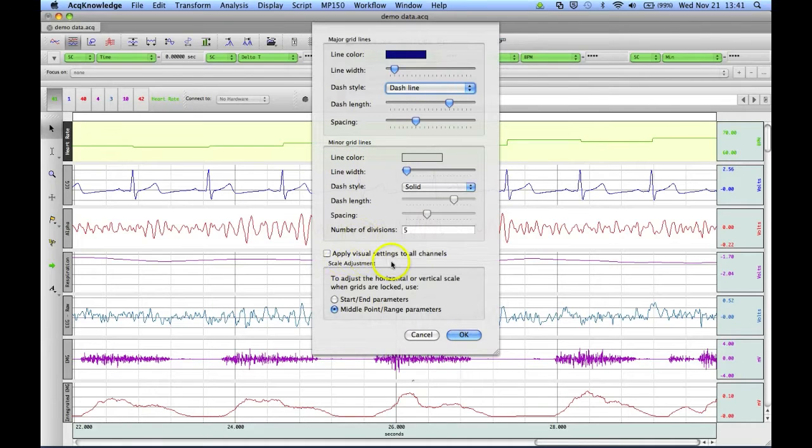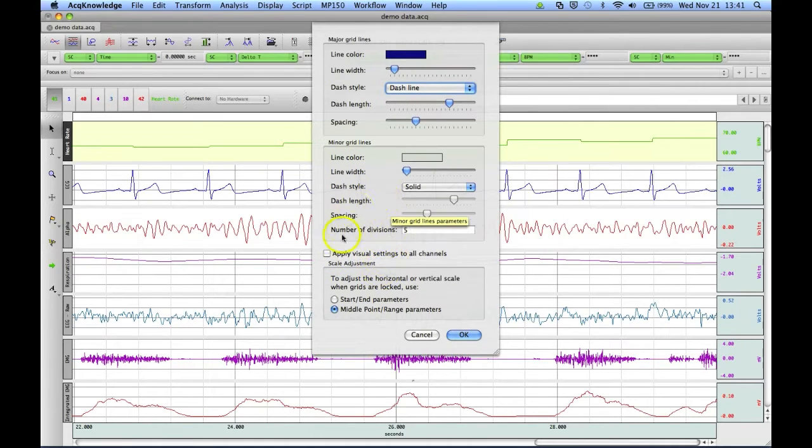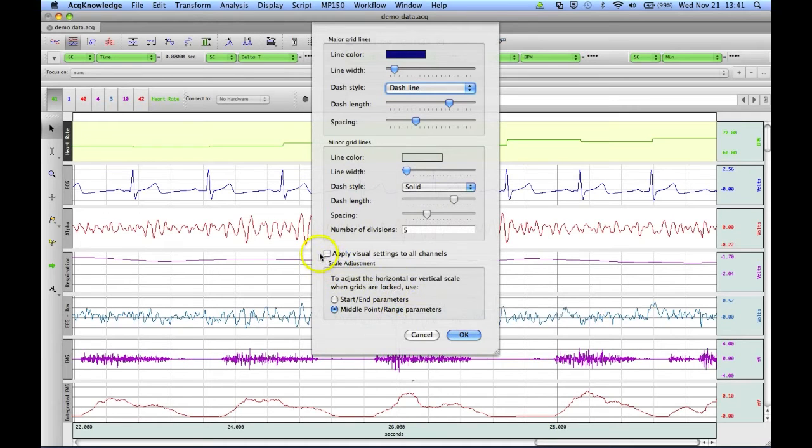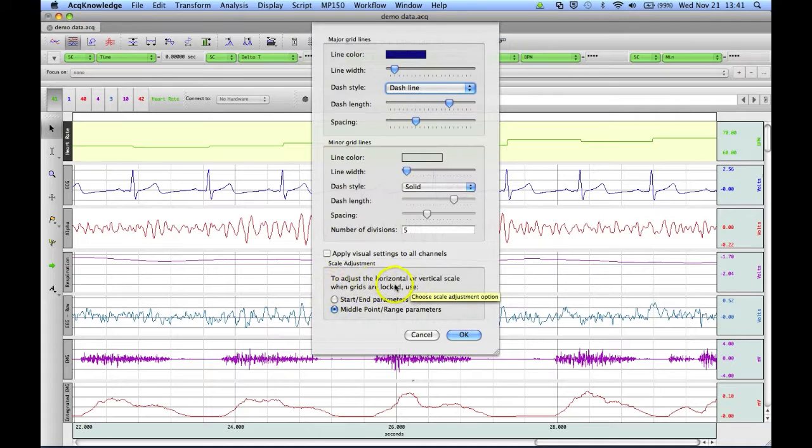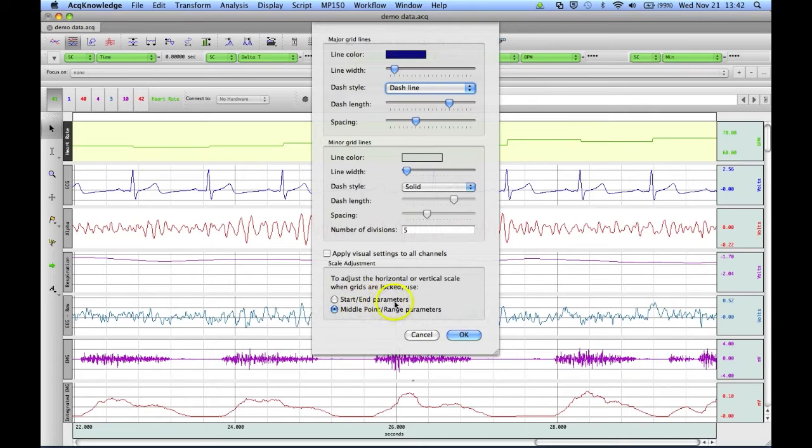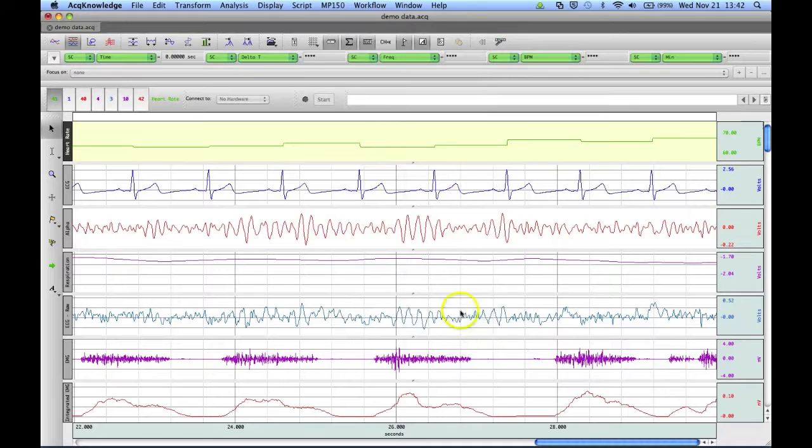Choose to apply this to all channels, or just for this specific channel, so we'll leave that unchecked so it just applies to this channel. For doing a locked grid, we can choose to adjust the horizontal or vertical scale based by start or end parameters, or middle point or range parameters. You can then click on OK.